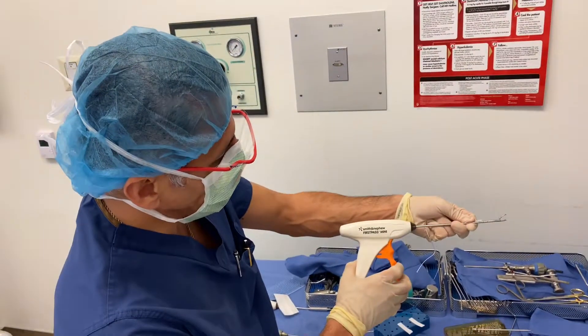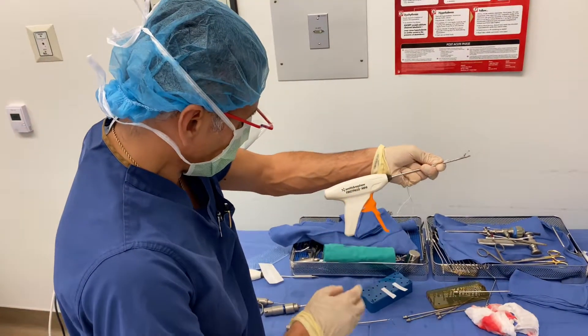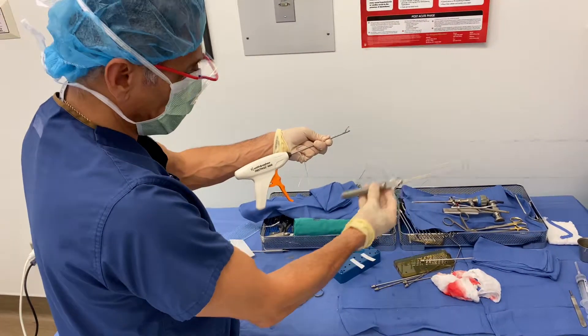Dr. Mar here. This is how I fix my root repairs. I either use a Smith & Nephew first pass or mini first pass, or my backup is an old school spectrum type pass, which I'll show you what I do.